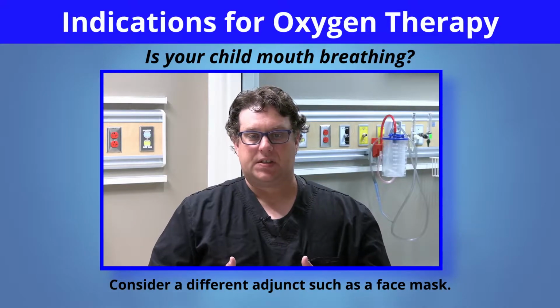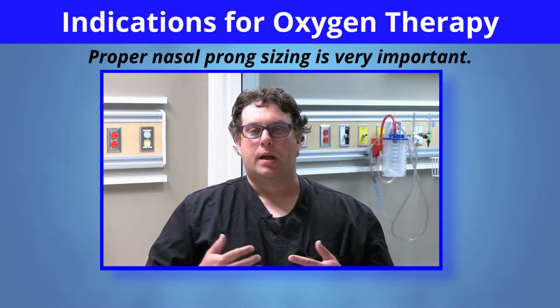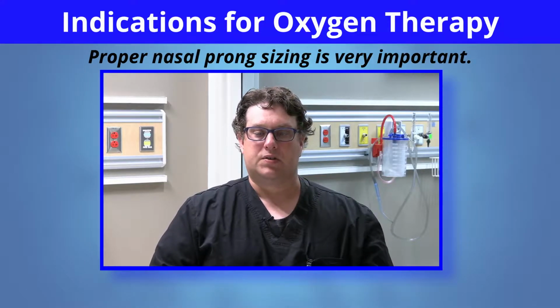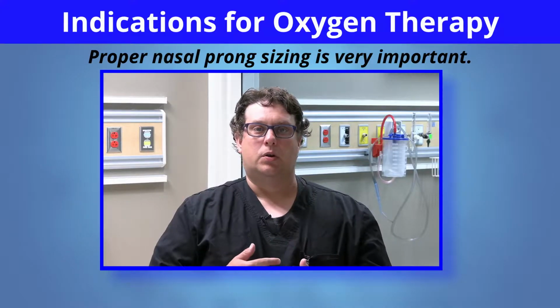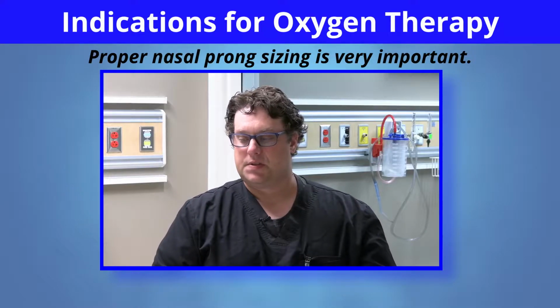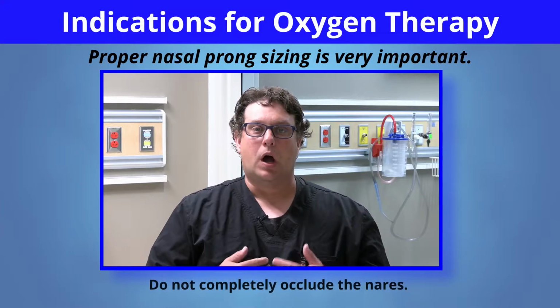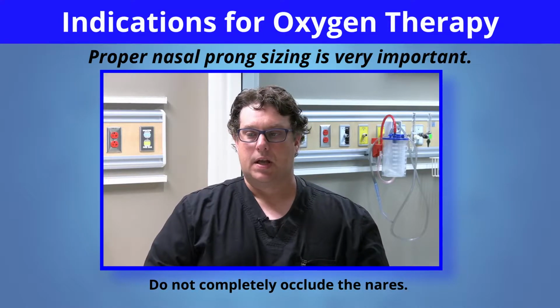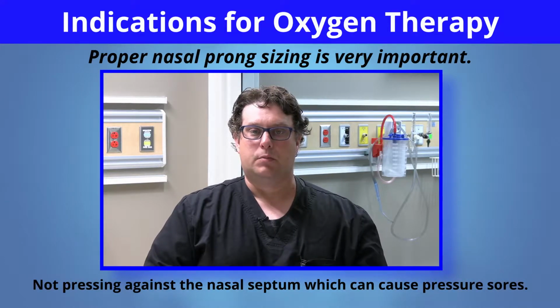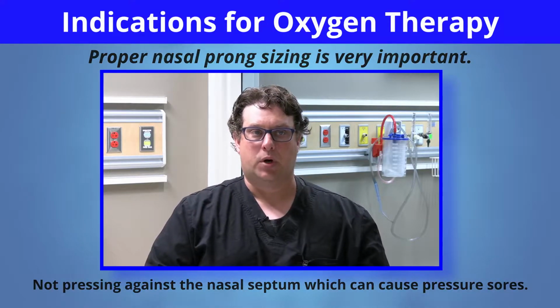Again, we talked about patient size selection, and then proper fitting of nasal prongs is really important. Different manufacturers have different features with sizing regarding their nasal prongs, so it's up to you to know what is available to you at your organization in terms of supplies when it comes to nasal prongs. The biggest thing to worry about with nasal prongs is to make sure that they're not completely occluding the nares and that they are fitting and not pressing against the nasal septum, especially if they're going to be used long term, because it can cause pressure injuries or skin breakdown.